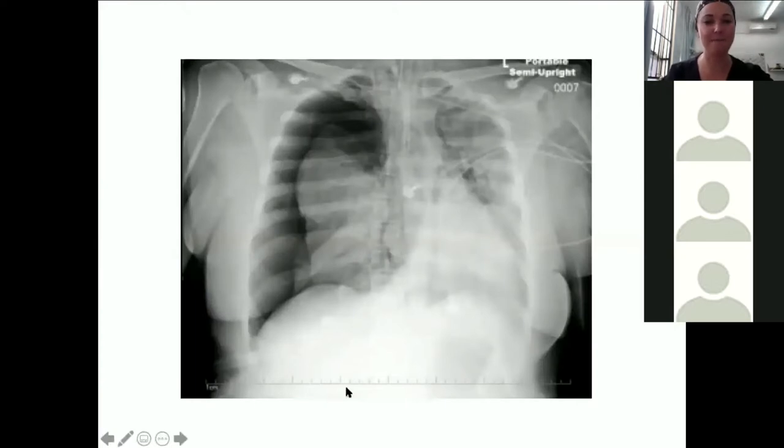Last poll, let me bring it up here. What can you see? Yes, all the answers are coming through correct. That's very hopeful. Most of the answers are coming through correct. Fantastic. Let me stop that there. We've all got more or less the right answer. Typical pneumothorax on the right-hand side. I'll show you in a sec.